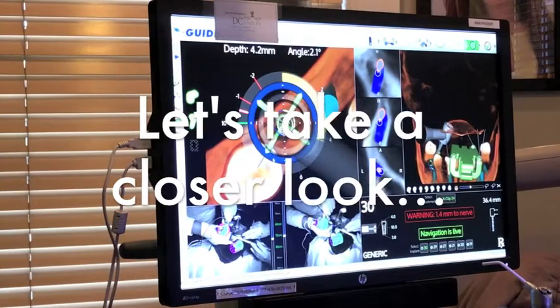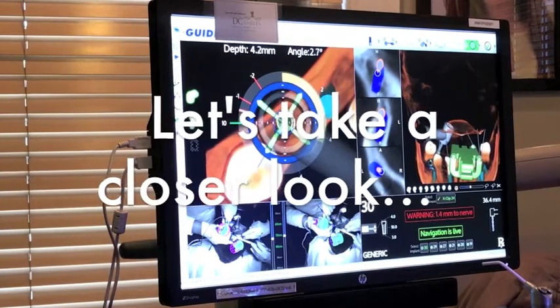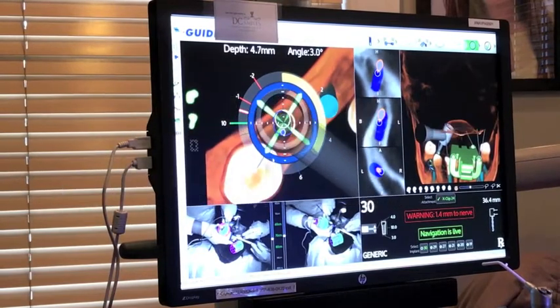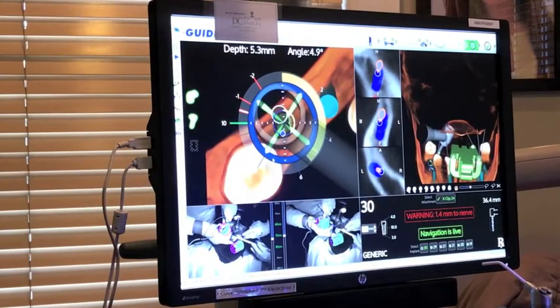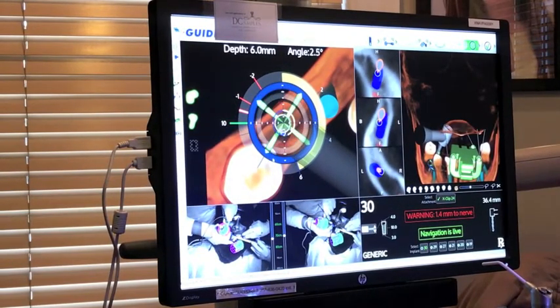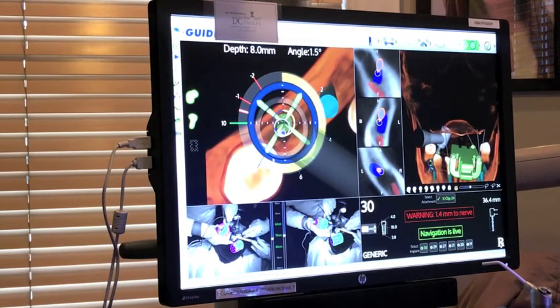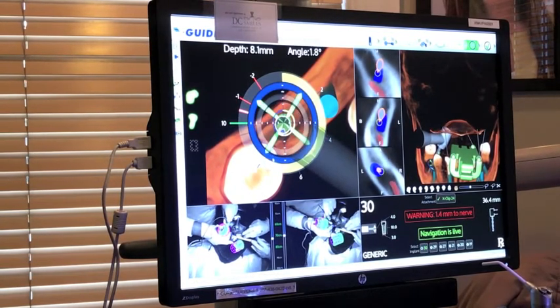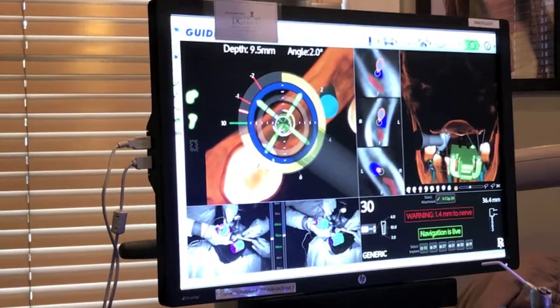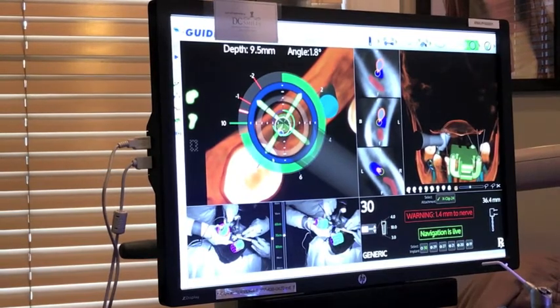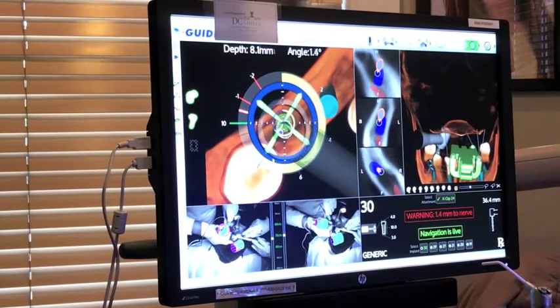A close-up of the screen shows the bullseye placement on the left. The middle panel shows the drill in three dimensions in accordance with our plan and proximal to the nerve. The color wheel around the handpiece signals the depth of the drill.